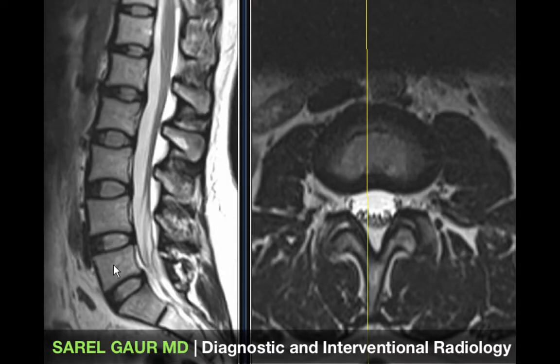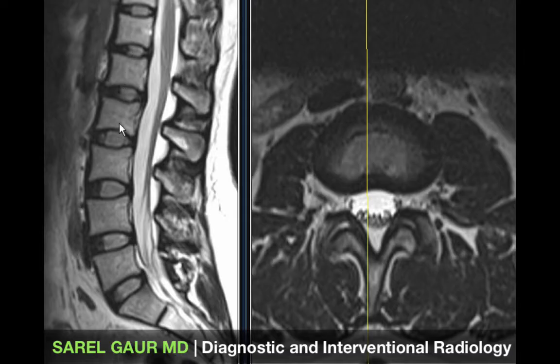Anteriorly I have the vertebral column — the vertebral bodies and the intervertebral discs. You can see how they all line up one on top of another with a gentle curvature, which is called the lumbar lordosis.